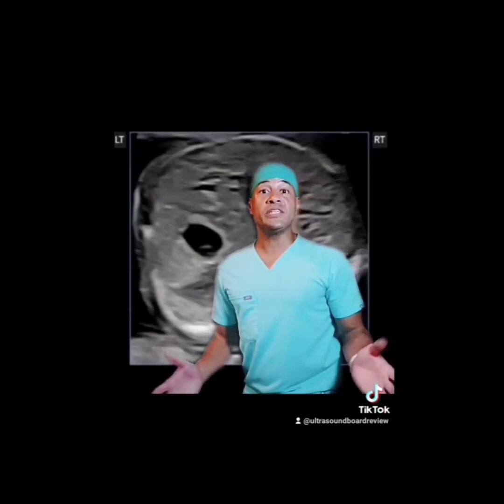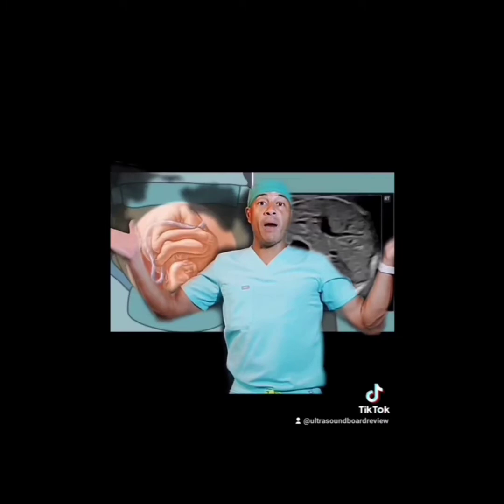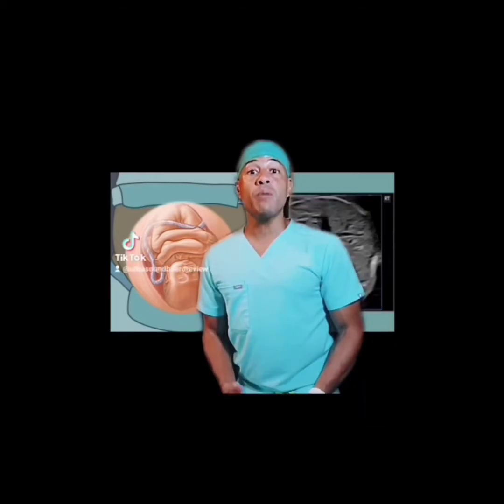The next thing we're going to do is determine the fetal situs. Now, these markers here don't just automatically pop up as if the machine can automatically determine the baby's orientation, so someone had to go in blind. On your boards, you might be expected to determine the fetal situs or fetal presentation without these markers here.